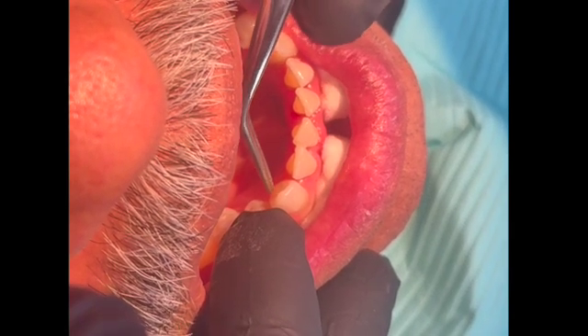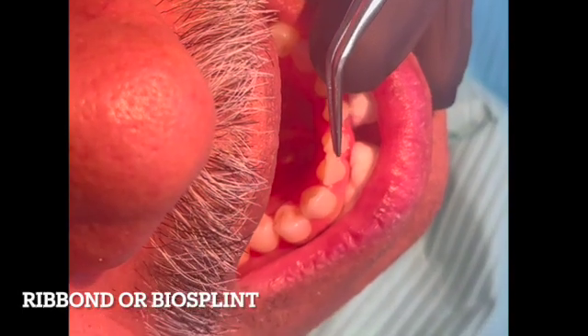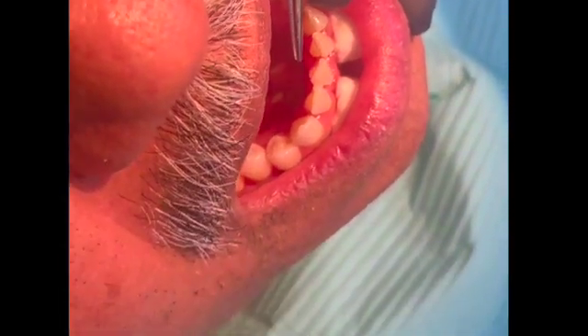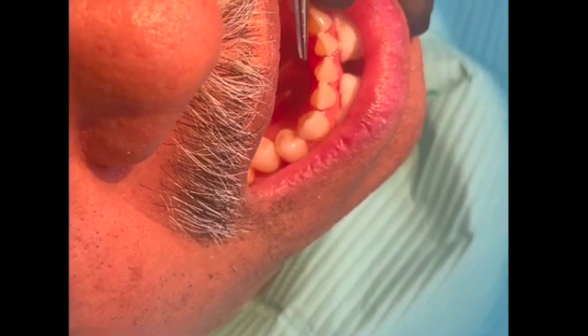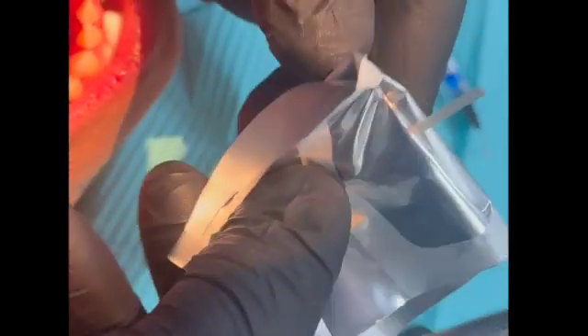Some of you may remember a product called Rib Bond. We don't have Rib Bond in stock, but we have another product called Bio Splint. It's basically a ribbon that will absorb the composite material and leave a nice flat splinting surface.